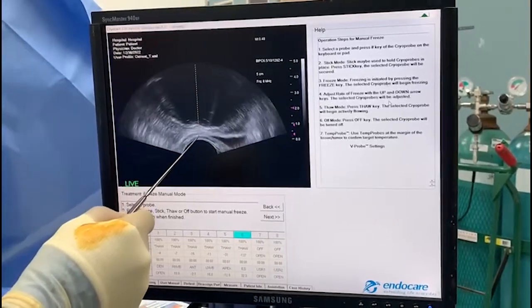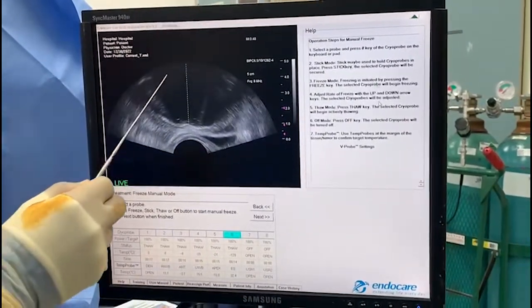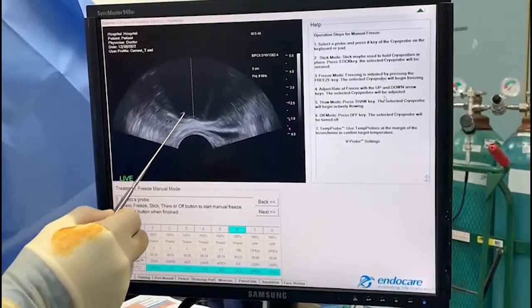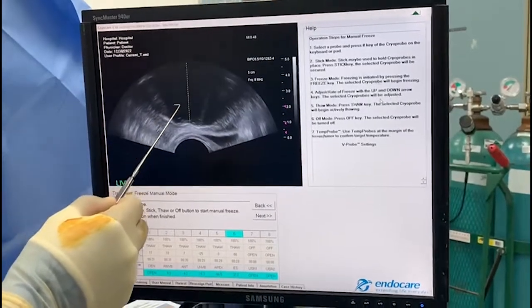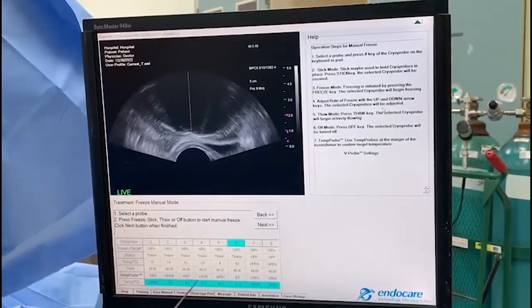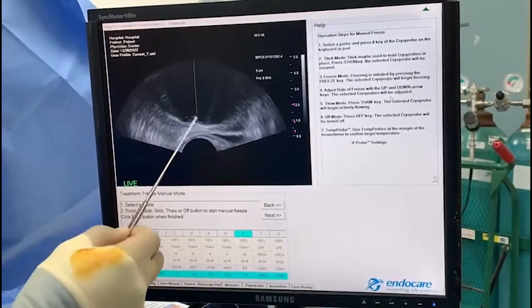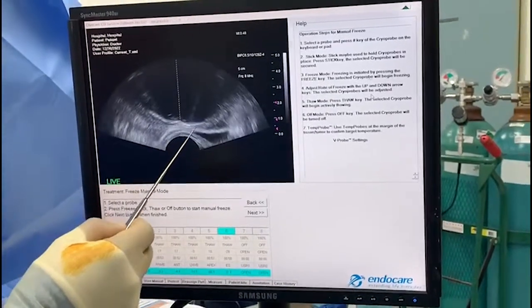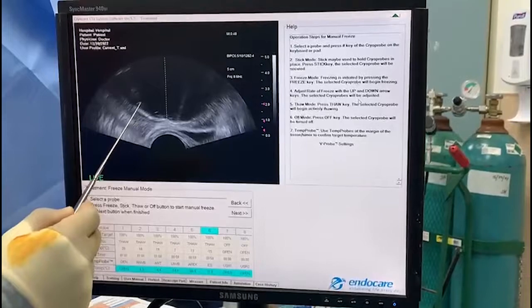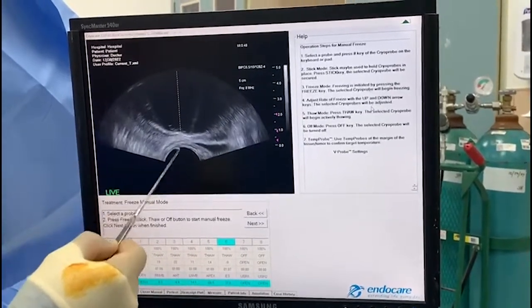We still have a great space of fat between the rectum and the Denonvilliers fascia. An important point about thawing is that you thaw from the inside out. It's super important — especially the leading edge of the ice ball — that you bring it down to a certain point. What I love about the argon-helium system instead of nitrous oxide or liquid nitrogen is that when we stop it, it generally only goes 10 more degrees Celsius from where I stopped it. So I can always anticipate that progression, and it will back up 10 degrees.